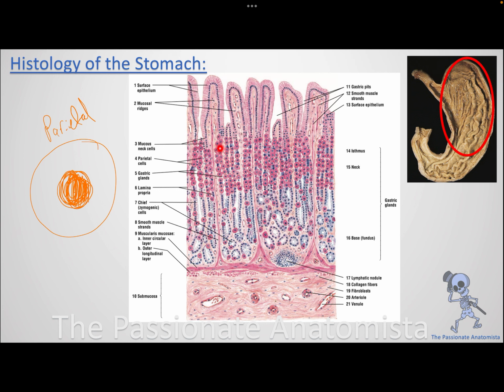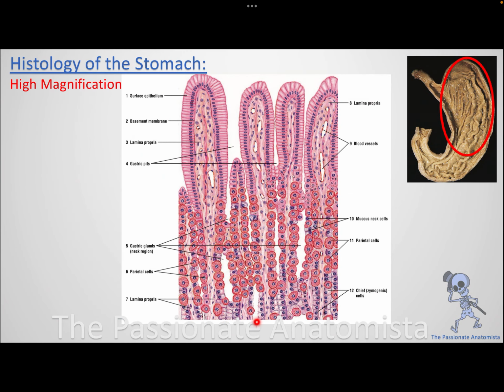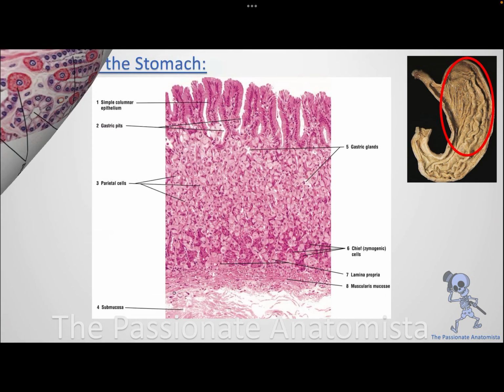As I proceed up, these cells are going to sense that and secrete the HCl into the lumen, and here it is going to activate the pepsinogen. Now look at how the parietal cells again have a fried egg appearance, and they are acidophilic. They are kind of reddish, and in a real histological picture, they are kind of pale. But the chief cells are basophilic. I'm going to show you real ones now, because now you know the idea, guys.